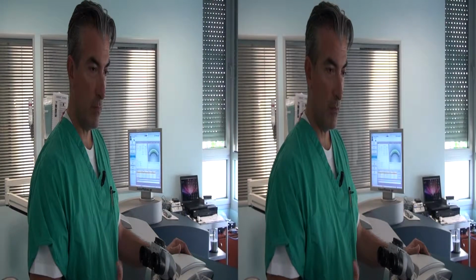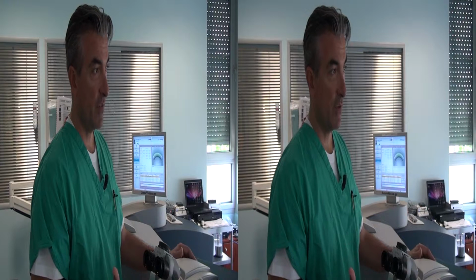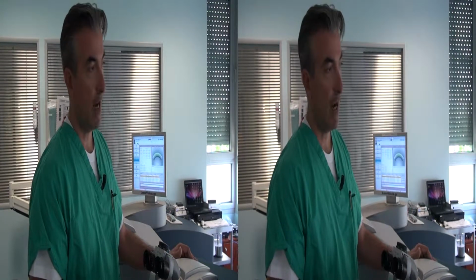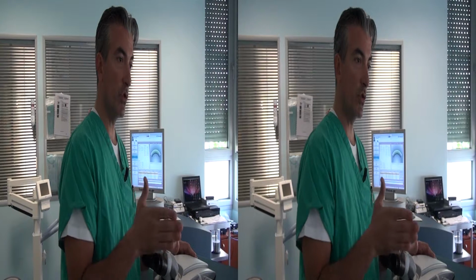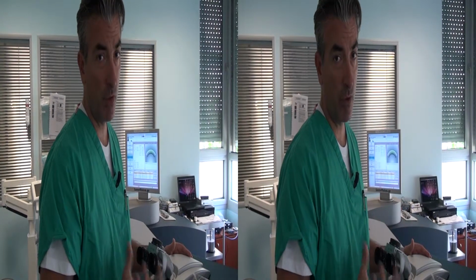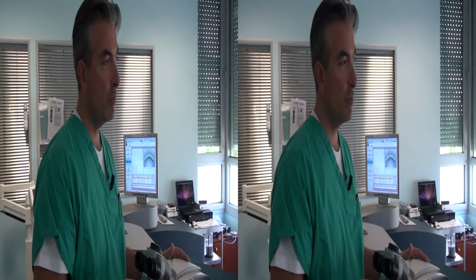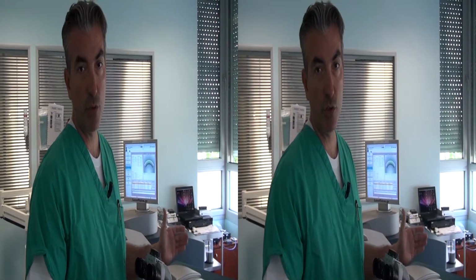So we do all our myopic treatments wavefront optimized. If there's significant astigmatism, we look into the topography guided option. We do all our hyperopes topography guided, here mainly in order to correct for angle kappa, which is present in most hyperopes. And I'll spend just a few minutes talking about the Athens protocol, which is our signature procedure.